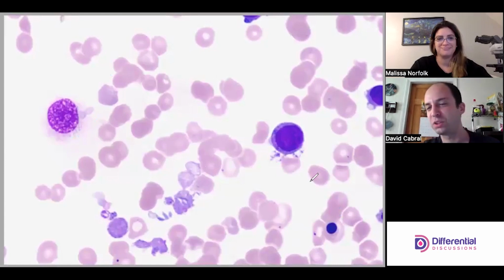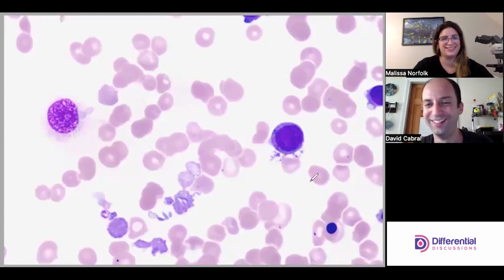You have to trust what's going on here, because really dark staining of a nucleus is actually indicative of problems with the cell. You can definitely have differential staining across these cell lines, and that's a clue of malignancy, a clue of abnormality. So don't throw away that valuable piece of information. I know you want to restain the slide and have everything look beautiful and normal, but you have to accept the facts on the ground sometimes, even if they're hard to deal with. Not everything is beautiful for us to look at, unfortunately. It's just the way it is.